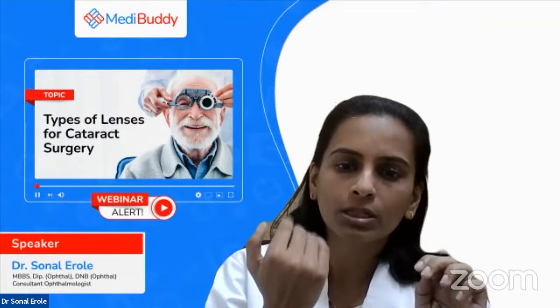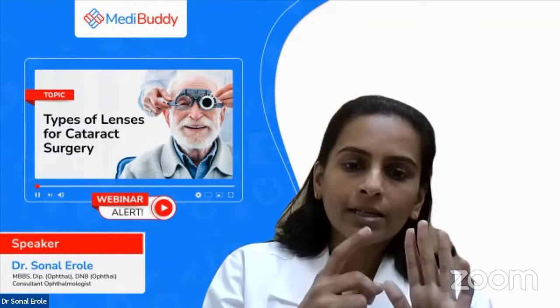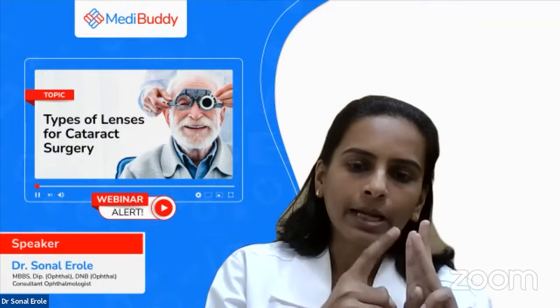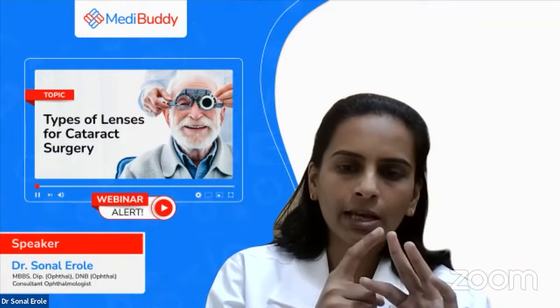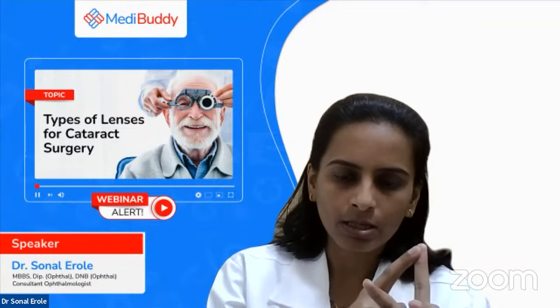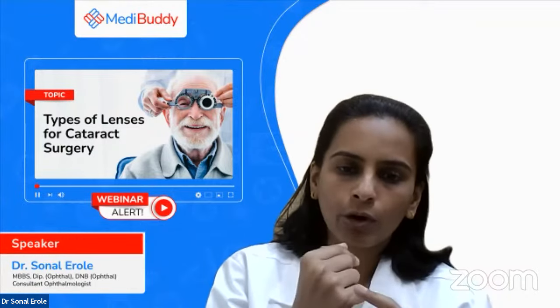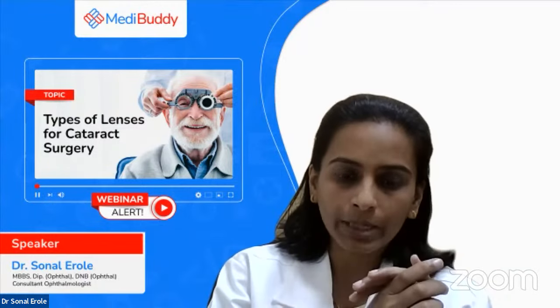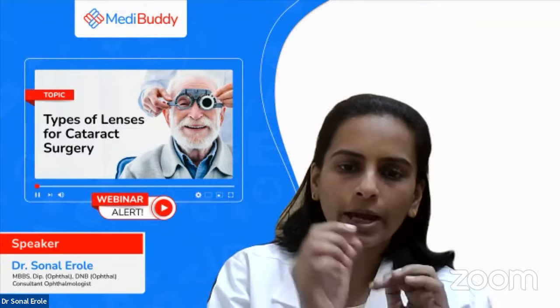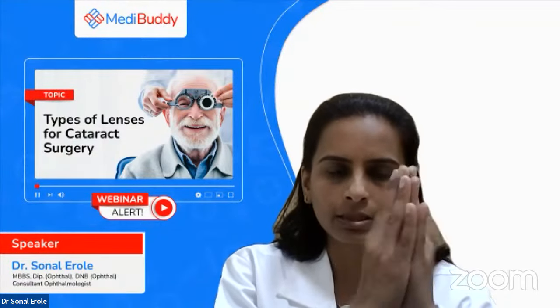So they need not use the glasses even for the near vision. Then comes the concept like EDOF. Why has this EDOF come? Basically, when we are going for the multifocal lenses, we are trying to replicate the lens which is given by God. But when we are making similar products, we are not 100% up to that point.